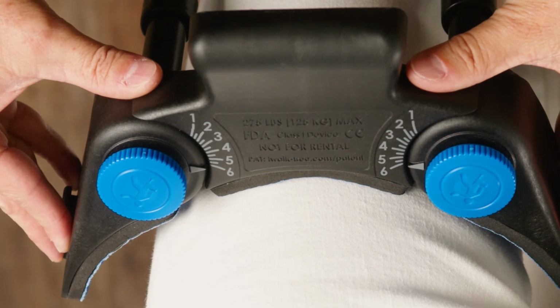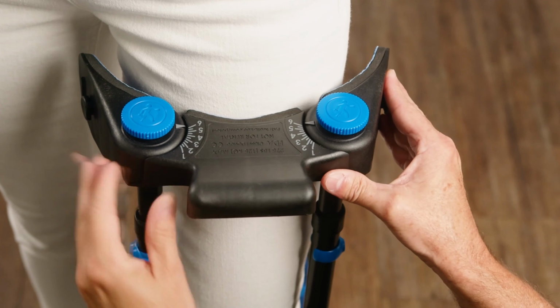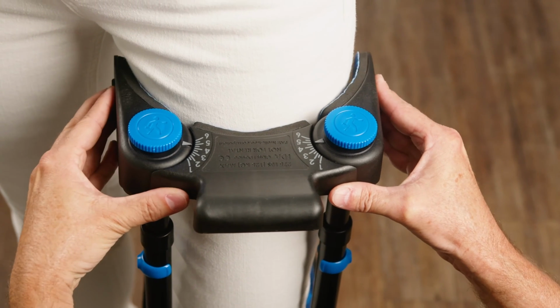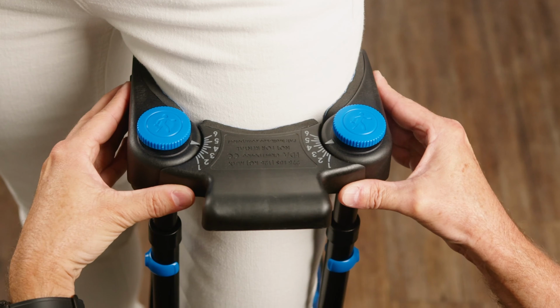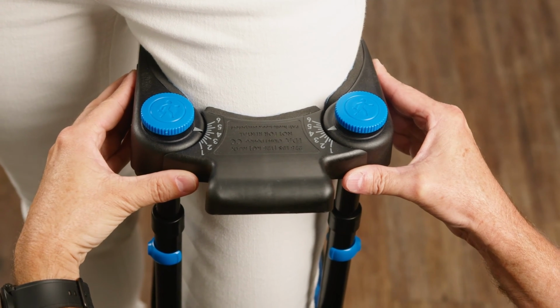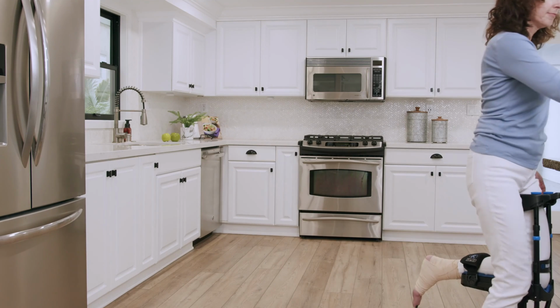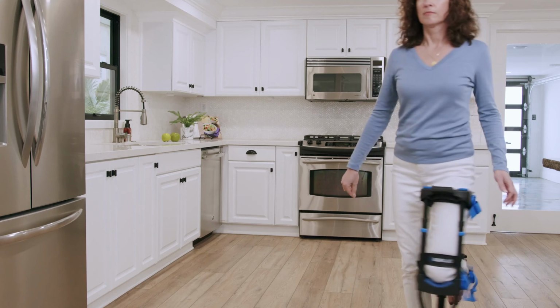Thigh supports. The thigh support adjustment serves 2 different functions. One is to fit the patient's thigh circumference. The other is to compensate for valgus or varus conditions. This is done through an asymmetrical arrangement of the thigh supports. When you follow our fitting process, thigh circumference and valgus, varus conditions are adjusted for automatically.